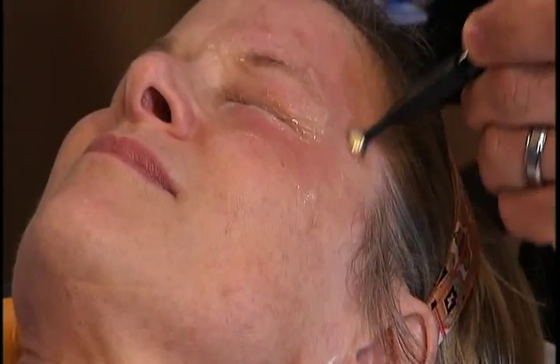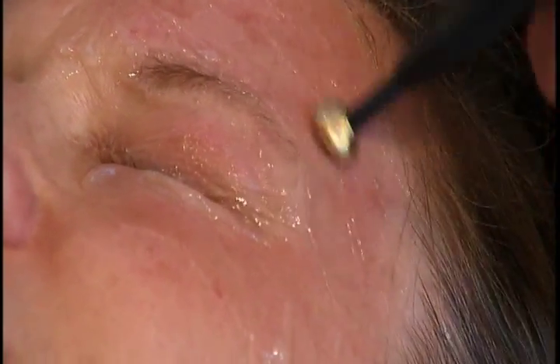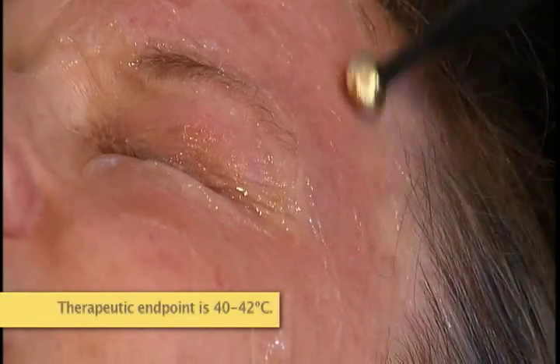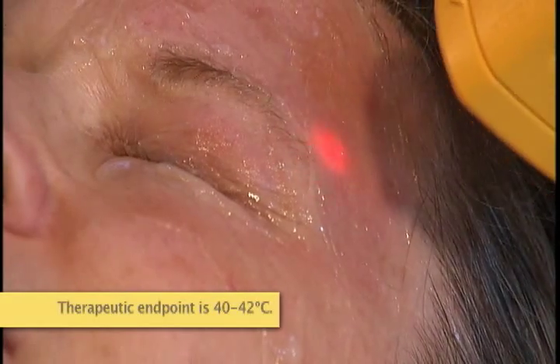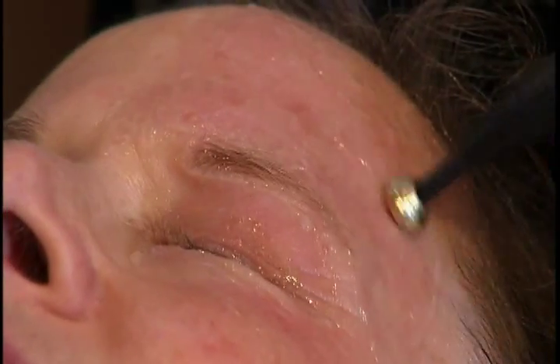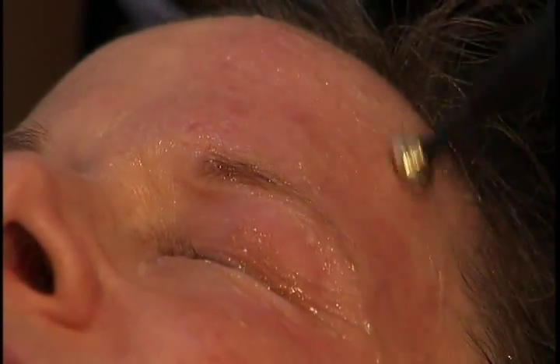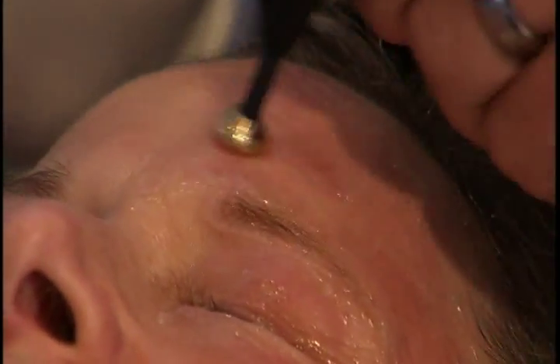And again, getting that to temperature right in that area doesn't mean I'm necessarily done with the pass. I want to make sure I have the whole area confluently heated. And right now, with this last pass, I was actually starting to see movement, contraction in the brow. And that was at 41, 42. So I'm at a therapeutic endpoint. I will sit her up each section so you can see. But right now, as I come across this temporal area, I'm seeing it draw up each time I pass over there.